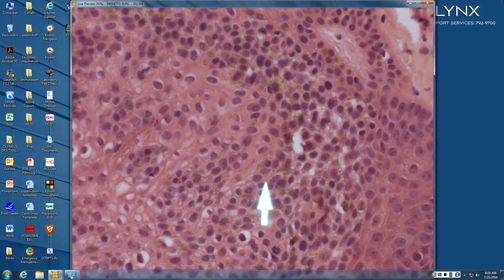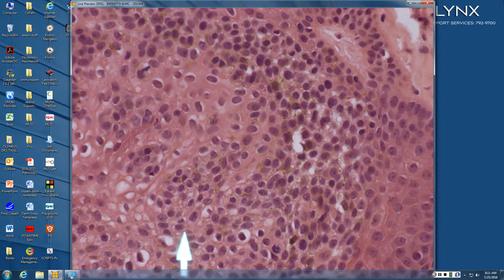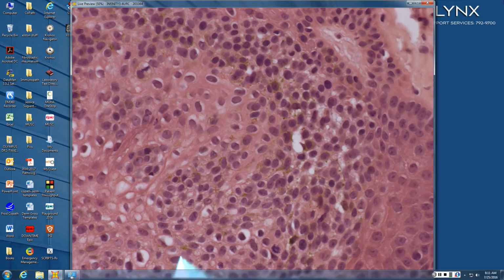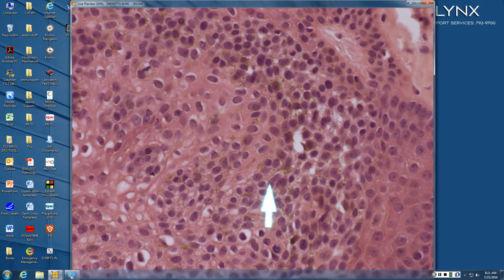Those are dendrites. Melanocytic dendrites, and they're all through this thing. In fact, when I look at it, I don't see much melanin in keratinocytes at all. There's a little bit. Melanin in keratinocytes is arranged as a cap on one side of the nucleus, like a little umbrella to keep the sun off the nucleus, right? I see one or two of those, but through most of the lesion, the melanin has not transferred or left the melanocytes. It's retained all within melanocytic dendrites.